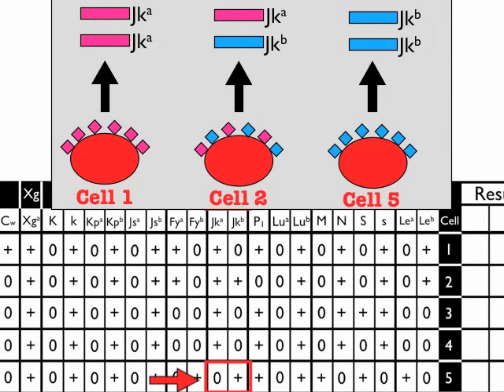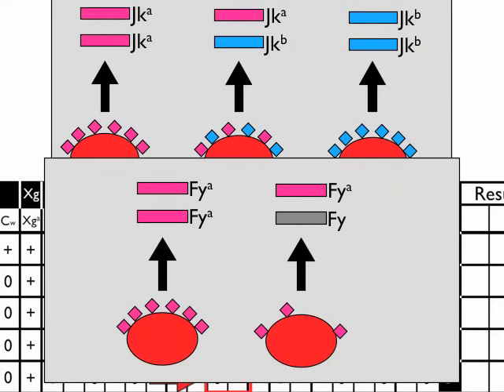Now, again, let me caution you that this is not always true, particularly in blood group systems like the Duffy blood group system. So if we see someone who is only displaying Duffy A on their red cell surface, in other words, you would see a plus for Duffy A and a 0 for Duffy B in that particular donor, you assume that what you have is the situation on the left, that that individual has a double dose of Duffy A. However, as I said before, if they have a null gene, which many African Americans have, in fact, the majority of African Americans have a null gene at at least one of the loci for Duffy, then actually all you have on the surface of the red cell is a single dose of Duffy A antigen.